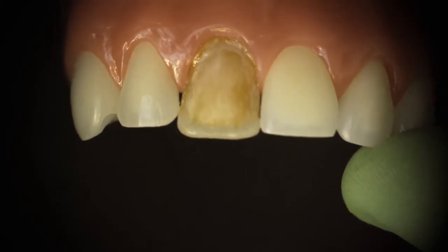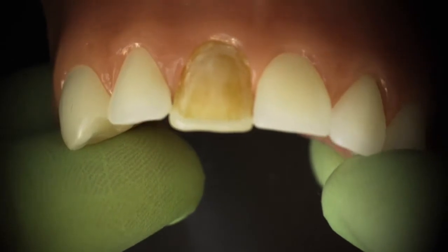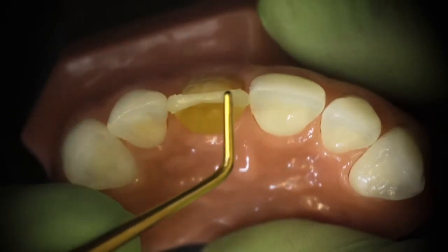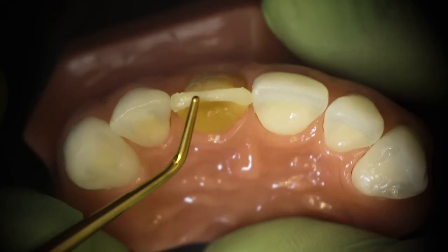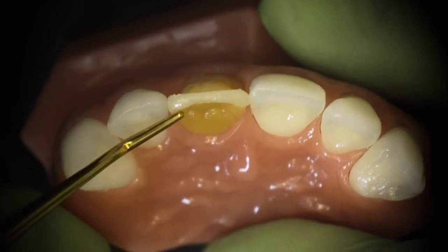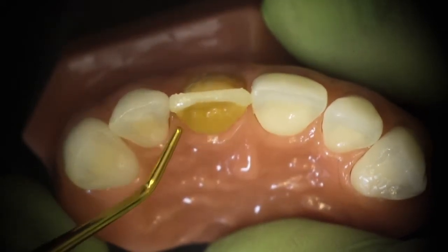I want to take a look from the incisal before I do my curing to make sure that my incisal edge is not too facial. This is where I'm looking to confirm that I'm supporting the incisal edge with the nano composite, because I don't want to rely on the microfill to support that edge — the microfill just doesn't have the same flexural strength.